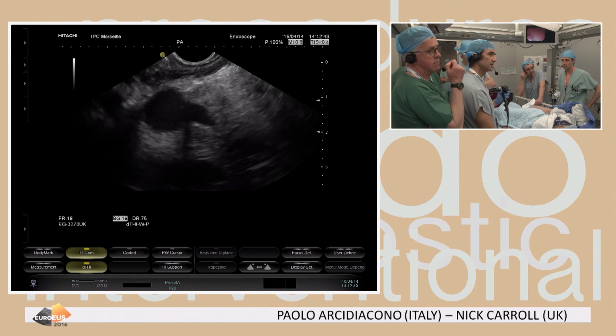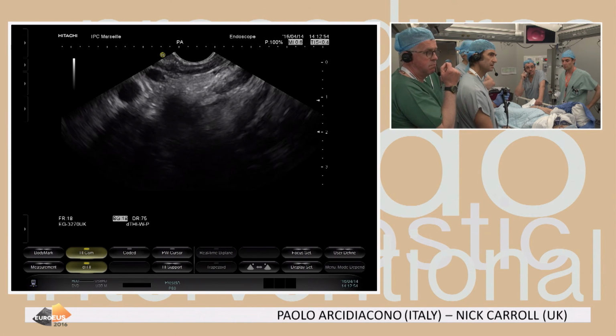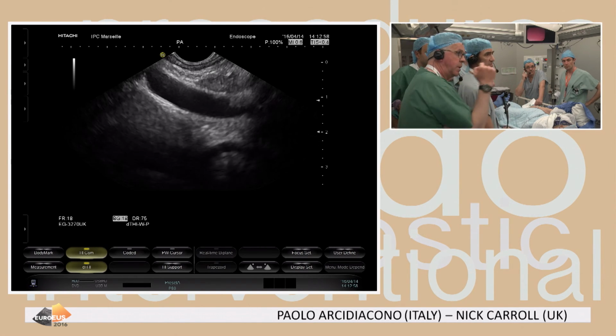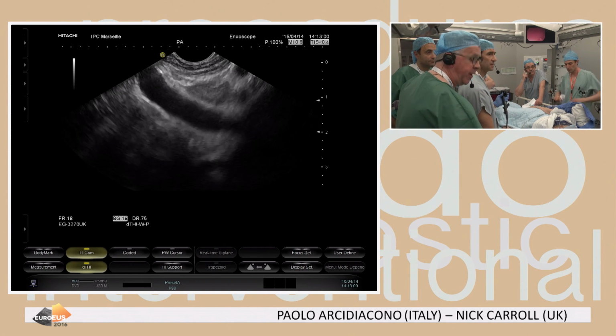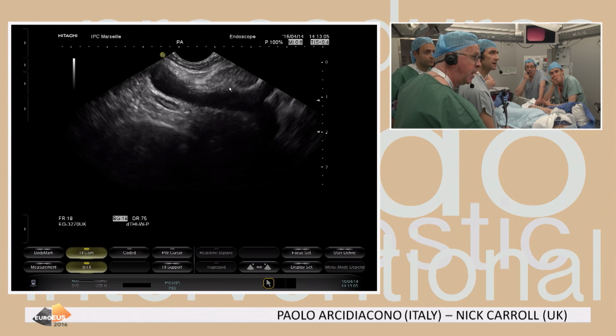So if it's a new lesion, and you see the way you described, she presented with the first lesion, she's a young person. I think it may not be unreasonable to say, look, we know that it's a very aggressive disease. Maybe, interestingly, there's a small lymph node here as well. It looks triangular.